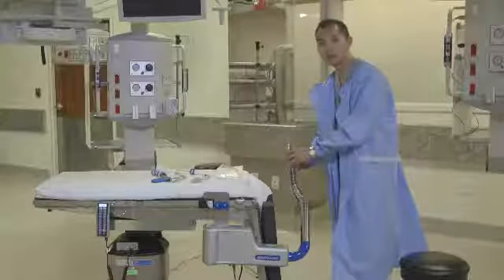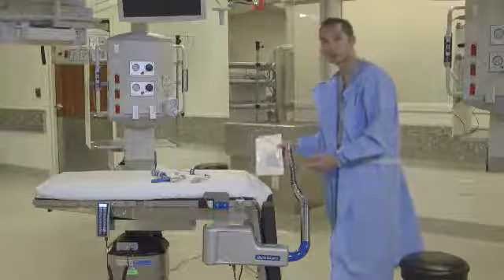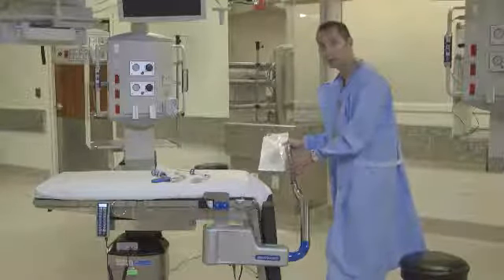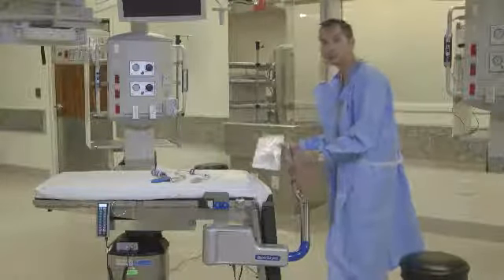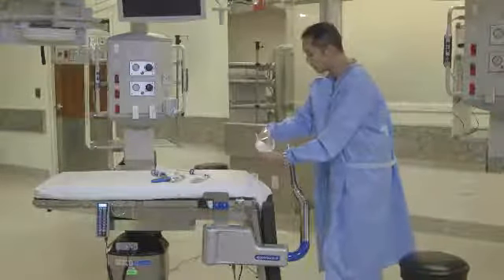So now we're going to talk about draping the ALI UPS. And as you can see, there's a specialized drape that's customized for this particular product that actually allows for easy draping of the instrument without compromising the sterile operative field. And so here I'm going to go ahead and open the packaging.